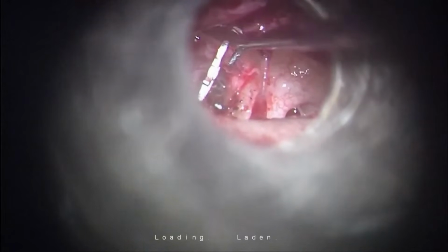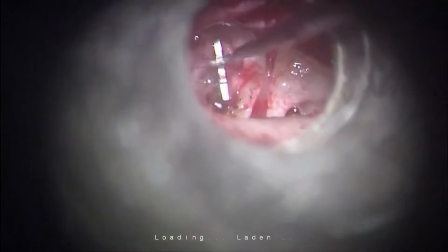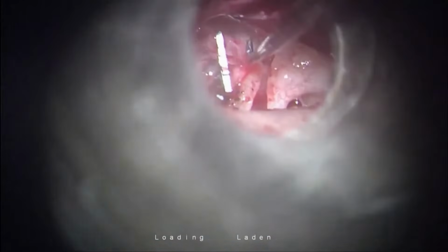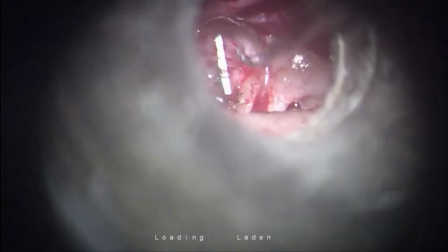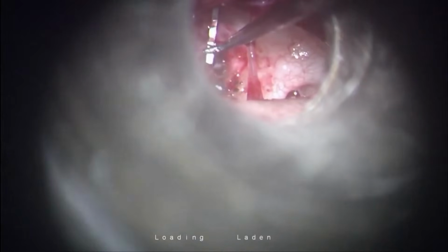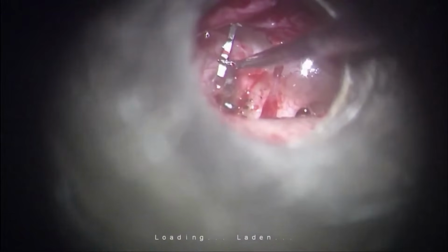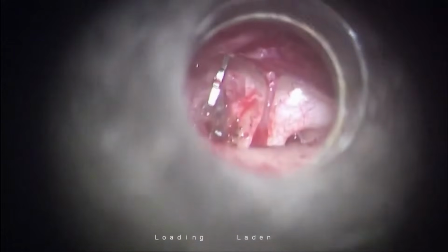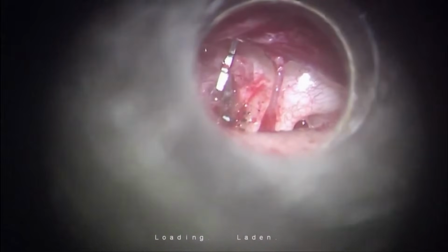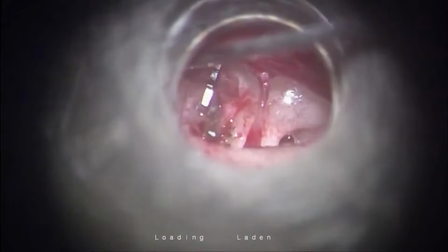I will ascend roughly, it should be 1.5 millimeters from the edge of the lenticular process. You just simply push. See that? Yes. The middle slot of the piston is going to take the long process of the incus. So simple. The simplicity is the best thing about stapes surgery you can think of.